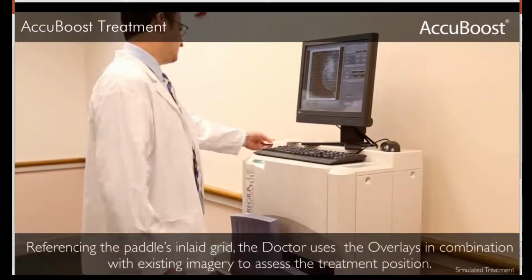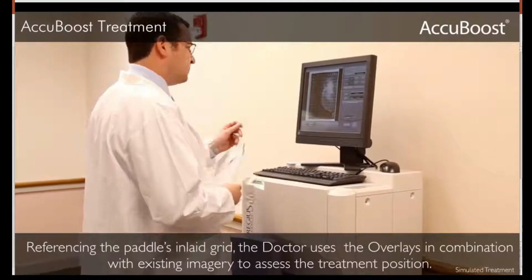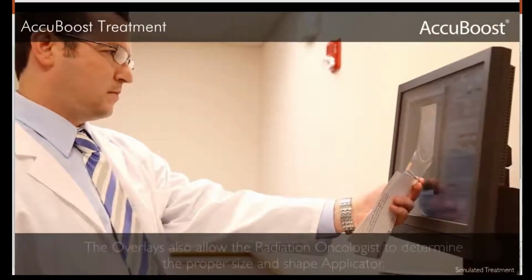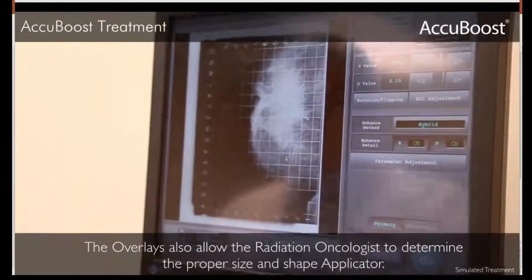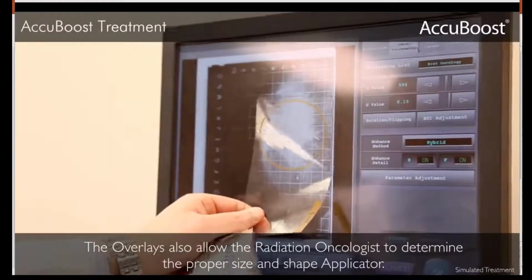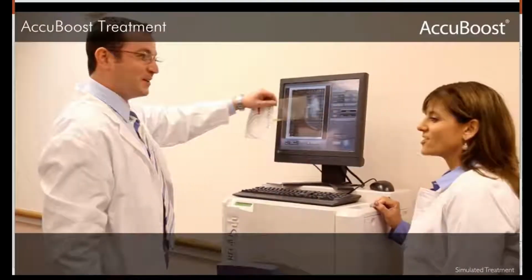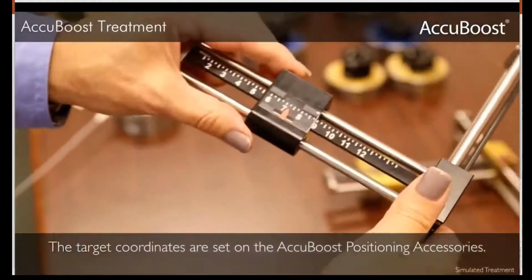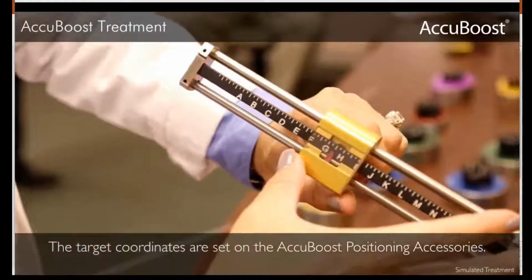And the radiation oncologist then looks at this image, and you'll see on the image, we'll get into this a little bit more in the presentation, a coordinate grid, and that coordinate grid is used to select the position of the applicator, and the radiation oncologist selects the type and shape of the applicator that's to be positioned. Once that is done, the coordinates are given to the therapist, who sets the machine up for treatment delivery.